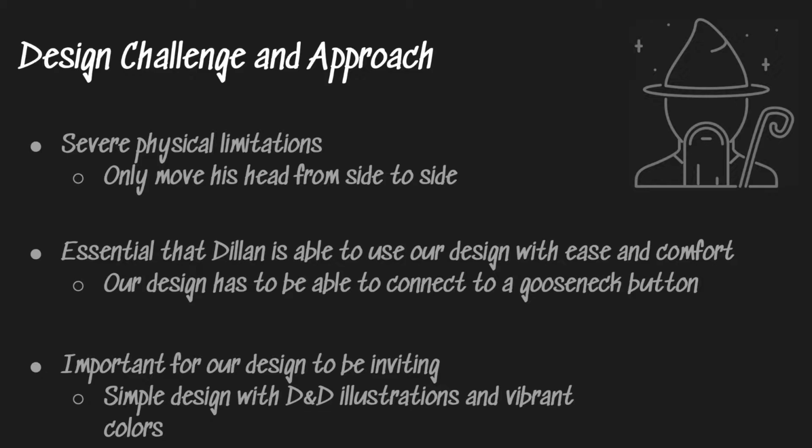For our design challenge, since Dillan can only move his head, there were severe physical limitations that had to be taken into consideration. For our design, we had to find a way that would allow our design to be able to connect to a gooseneck button for Dillan to use. We also added a simple design that included vibrant colors.